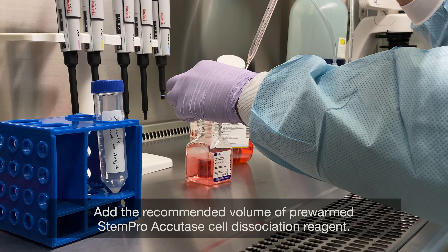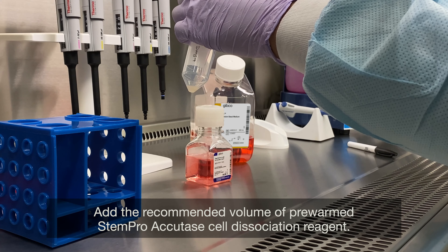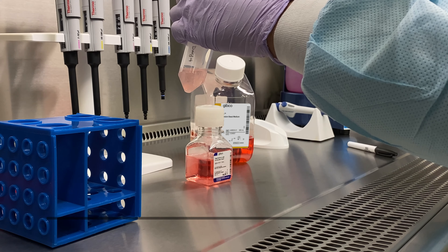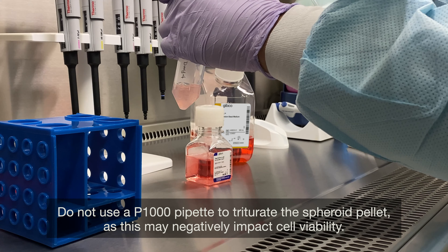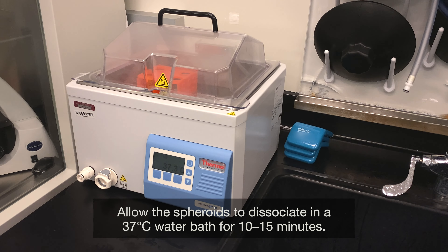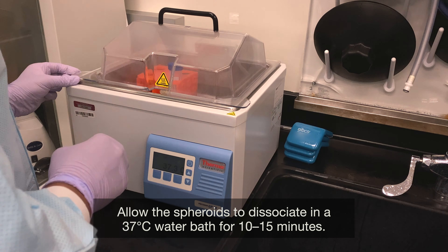Add the recommended volume of pre-warmed StemPro Accutase Cell Dissociation Reagent. Do not use a P1000 pipet to triturate the spheroid pellet, as this may negatively impact cell viability. Allow the spheroids to dissociate in a 37 degrees Celsius water bath for 10 to 15 minutes.